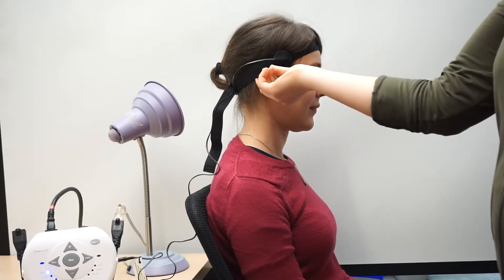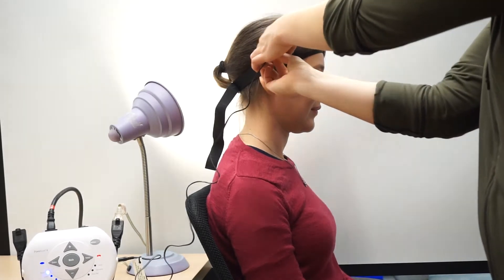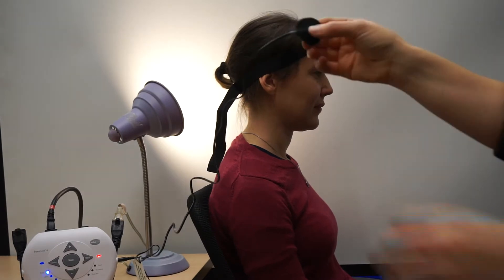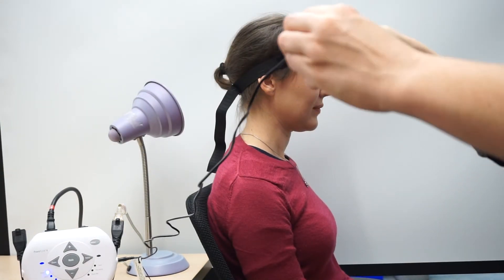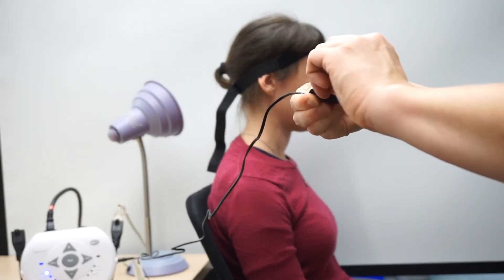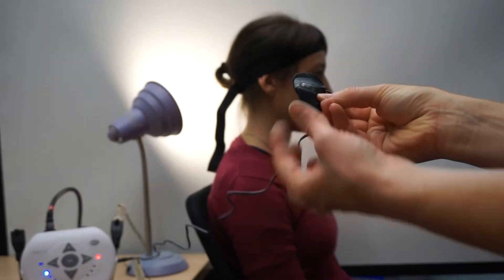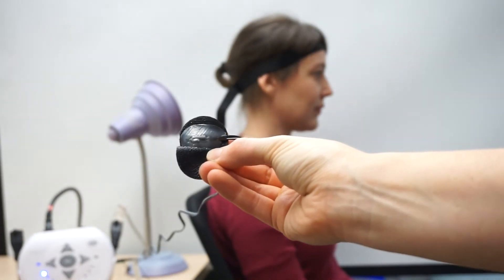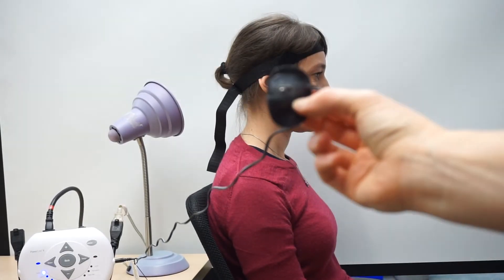To demonstrate how this Tilt Switch is working, I'll actually bring it up to the camera here. I'll peel apart the Velcro — you don't have to do this to your Tilt Switch, this is purely to show you how it works. You'll see a tiny ball of mercury here.